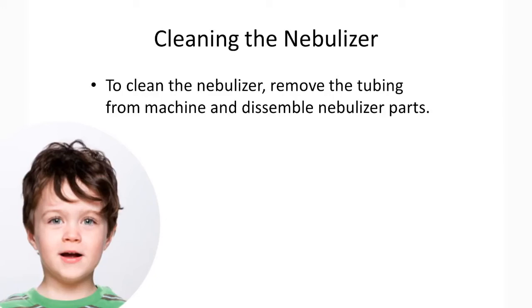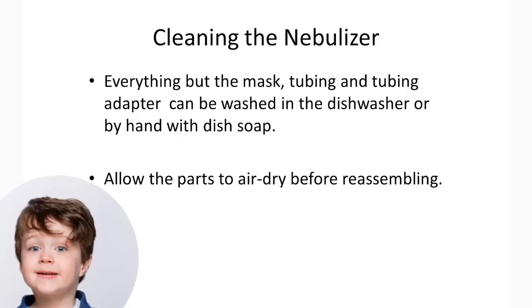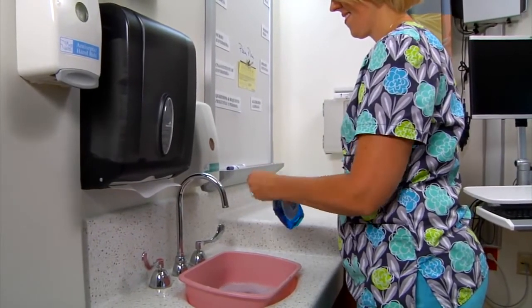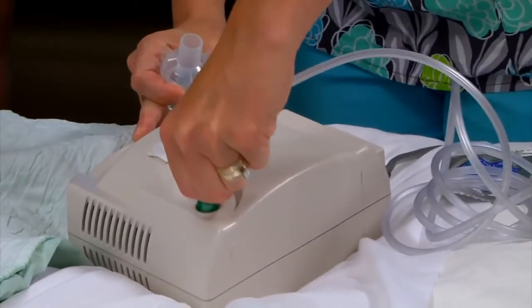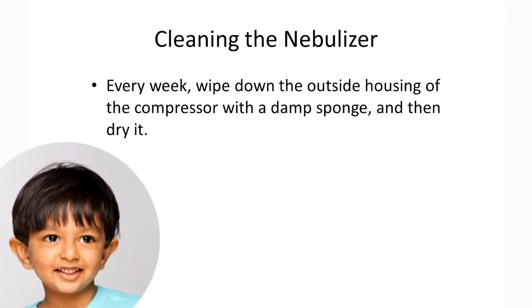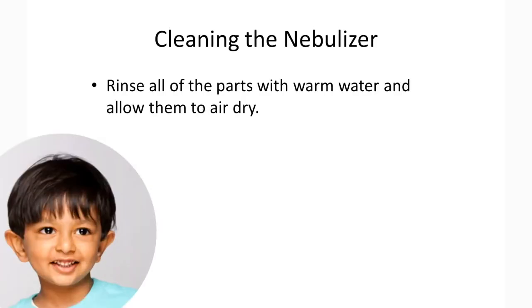So we have to remove the tubing parts from the machine and disassemble the nebulizer parts to be able to clean the machine completely. We wipe down the outside housing of the compressor with a damp sponge. And we sterilize all the parts except the tubing and the tubing adapter by boiling. We rinse all the parts with warm water and allow them to air dry.